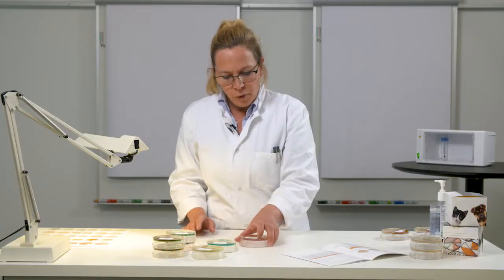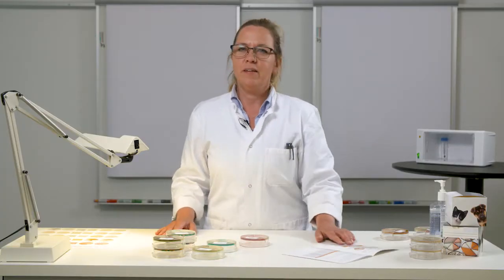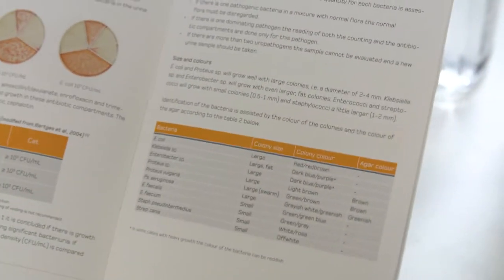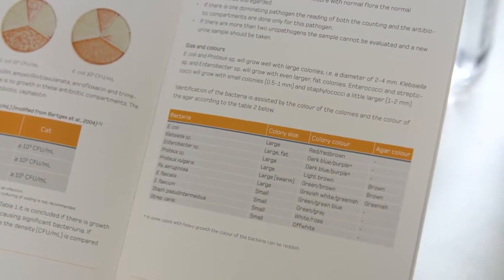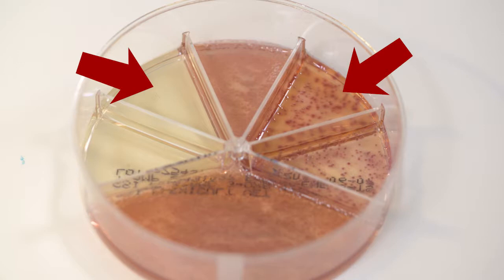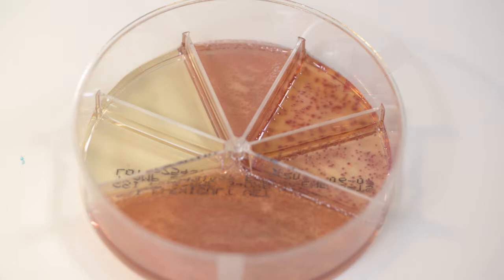It will be advantageous to use the manufacturer's information insert, containing distinct charts and pictures, which are useful for the reading of the plates. Bacteria density is evaluated in the large compartment. Here you can assess the amount of CFU per milliliter contained in the sample. And the growth or no growth of bacteria will show which antibiotics to choose for the treatment of the patient. I will now go through some examples of reading the plate.